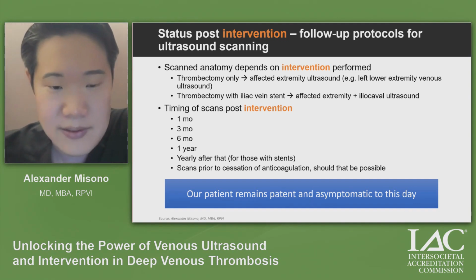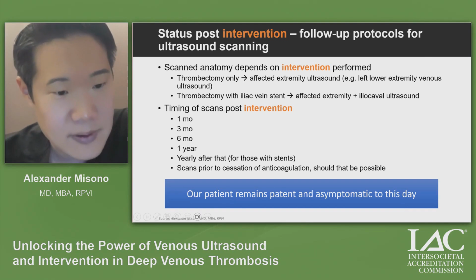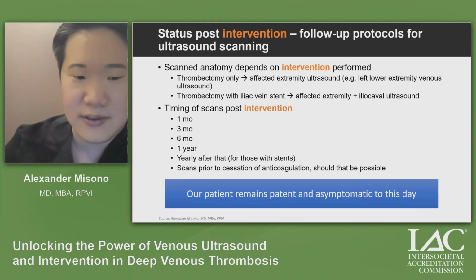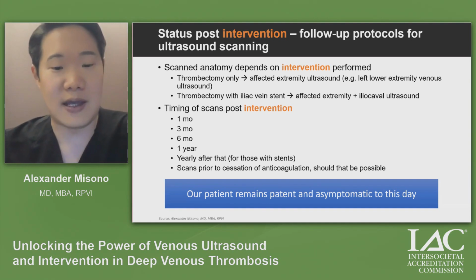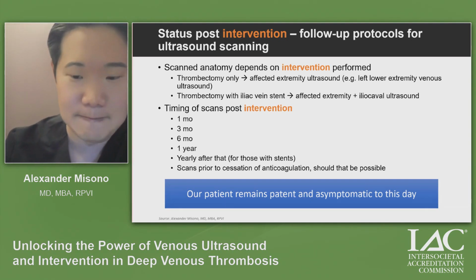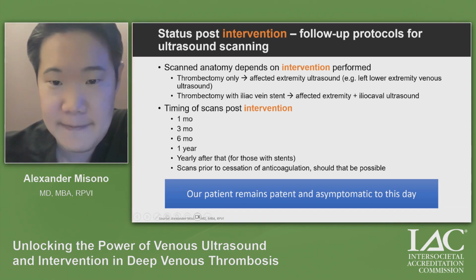I do follow a typical kind of normal timing for these. I follow them up usually at about a month, 3 months, 6 months, and then a year. And so it gives a bit of more intensive looks at the beginning. And then after a year, depends on the patient, I may continue to scan. If they have hardware implantation, such as a stent, I'm scanning yearly after that. Our patient, by the way, remains asymptomatic to this day.